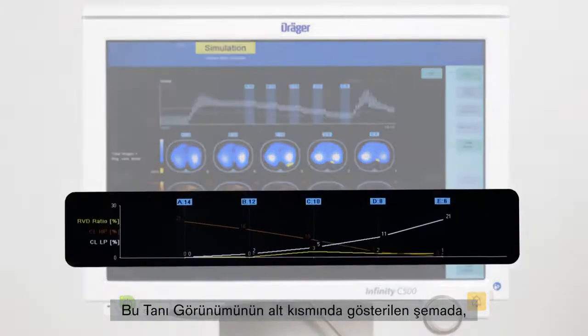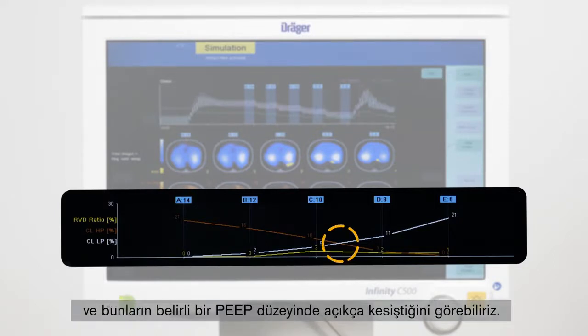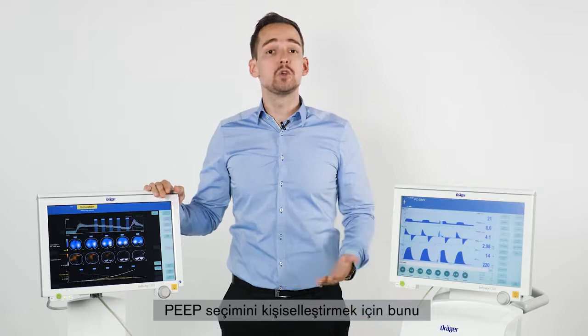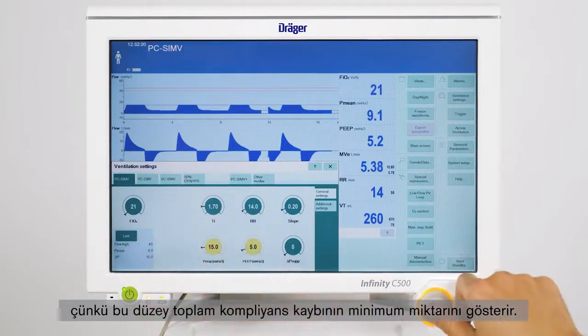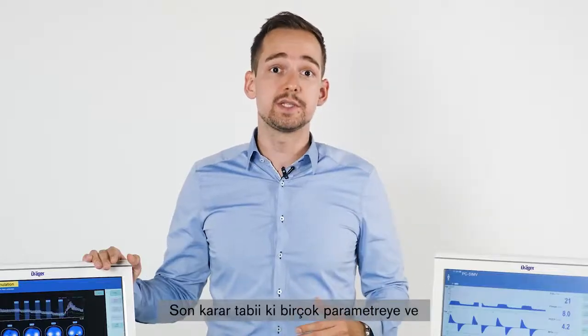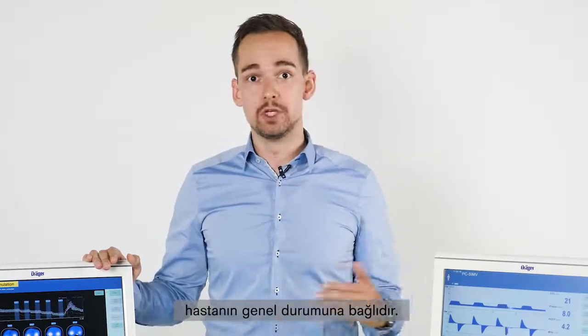In the diagram, which is displayed at the bottom of this diagnostic view, we can observe an opposing trend of collapse and overdistension with a clear intersection at a certain PEEP level. To personalize PEEP selection, we could choose this or the next higher PEEP level, as this level shows the minimal amount of total compliance loss. The final decision, of course, depends on multiple parameters and the overall patient condition.